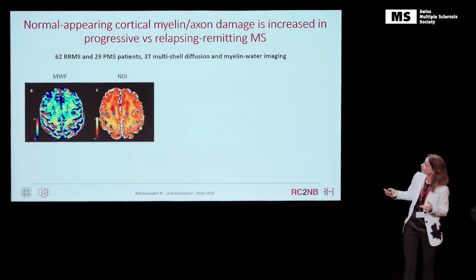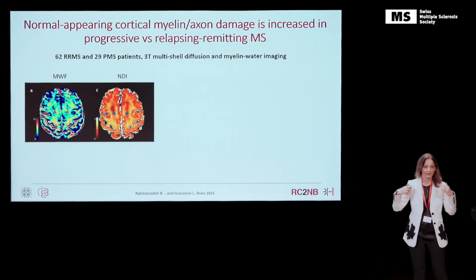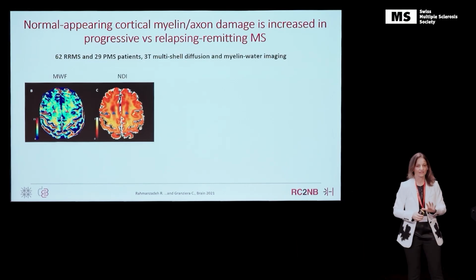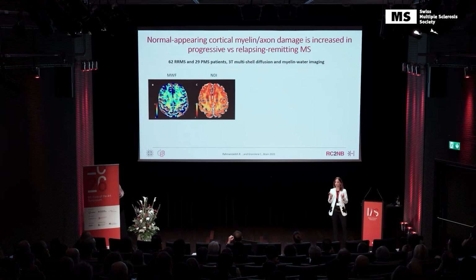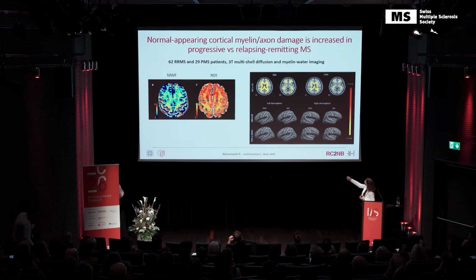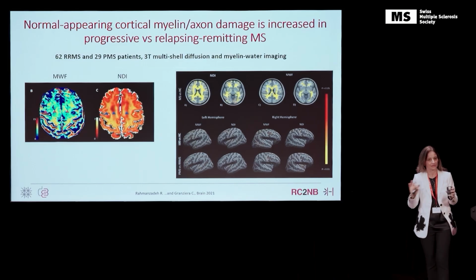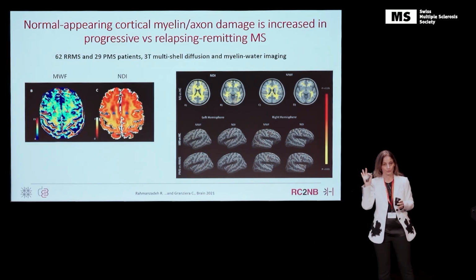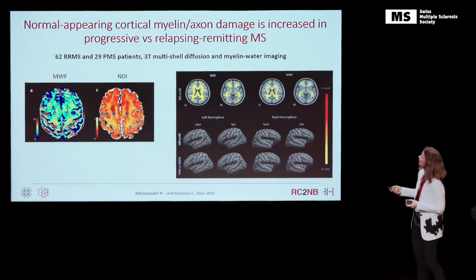And then I would like to show you a bit of normal appearing tissue. Again, these 2 maps, myelin water fraction and NDI, again a subgroup of the SMSC. This is tissue excluding lesions. We took away the lesions from the maps, both in gray and in white matter. And this is the result. So in white matter, of course, both. On the top there, you see the statistical maps showing you the differences between patients and controls in white matter. They're different, and that's it. But we didn't find any differences between progressive and relapsing remitting patients. Nothing in the white matter. We did find this in the gray matter.